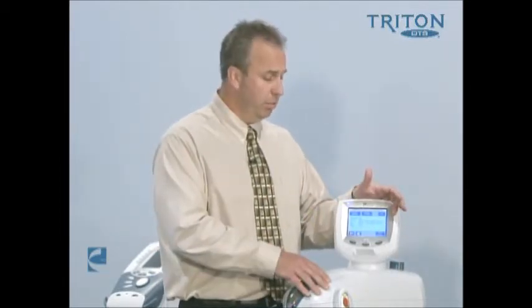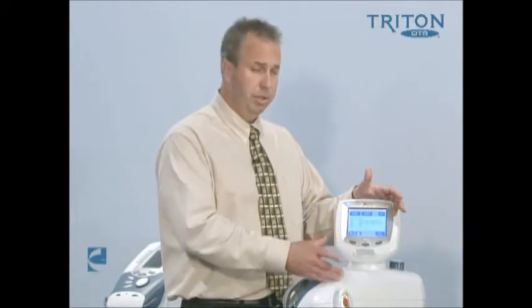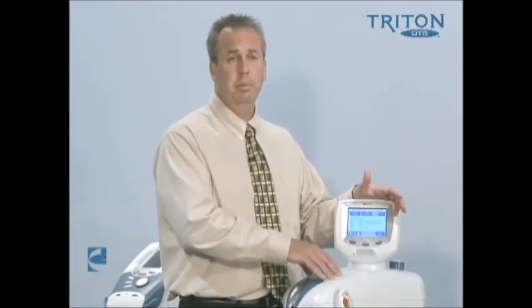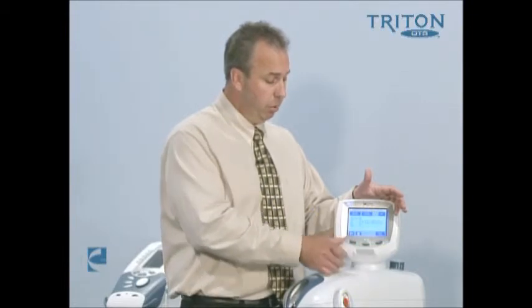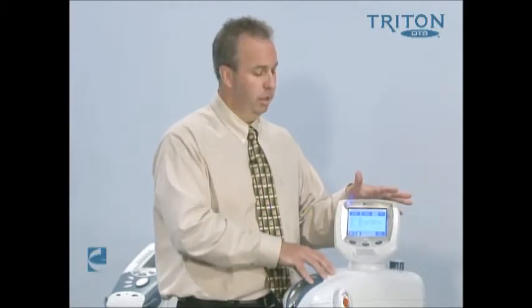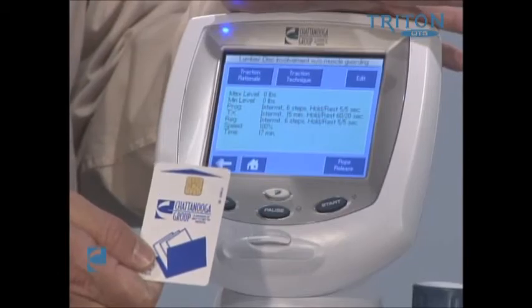After we're completed with a treatment, we'll have two options. One option is not to save anything, where it will just default and the machine will shut down. The other option is to save the treatment protocols — either to a patient card or within the device itself. If specific protocols are of benefit within our clinic, we can save them so we don't have to go in and edit each time. Patient cards can also be used to save individual patient parameters and track their progress.